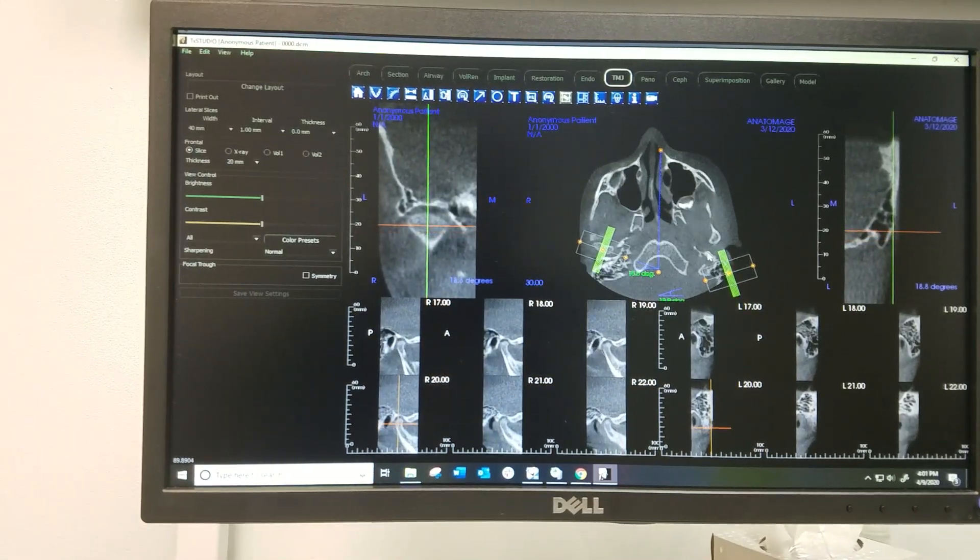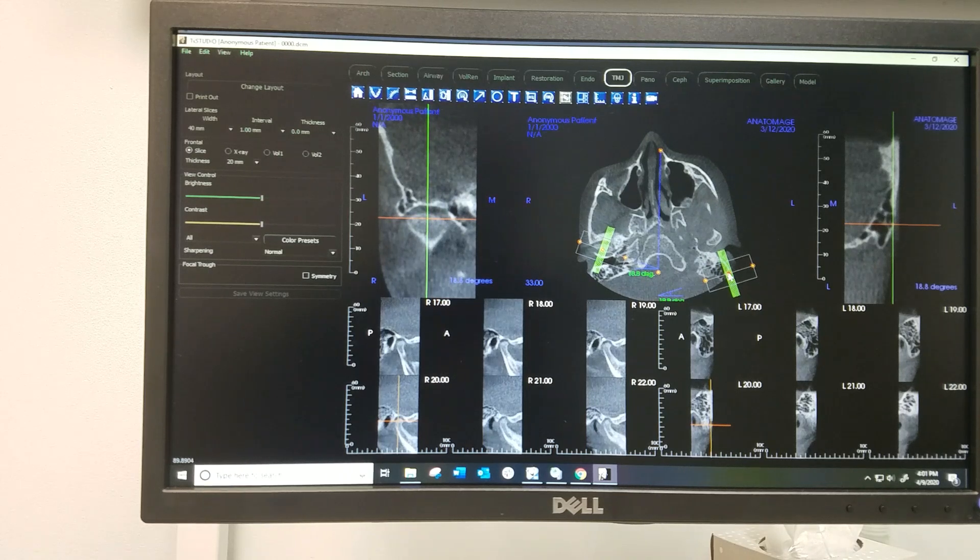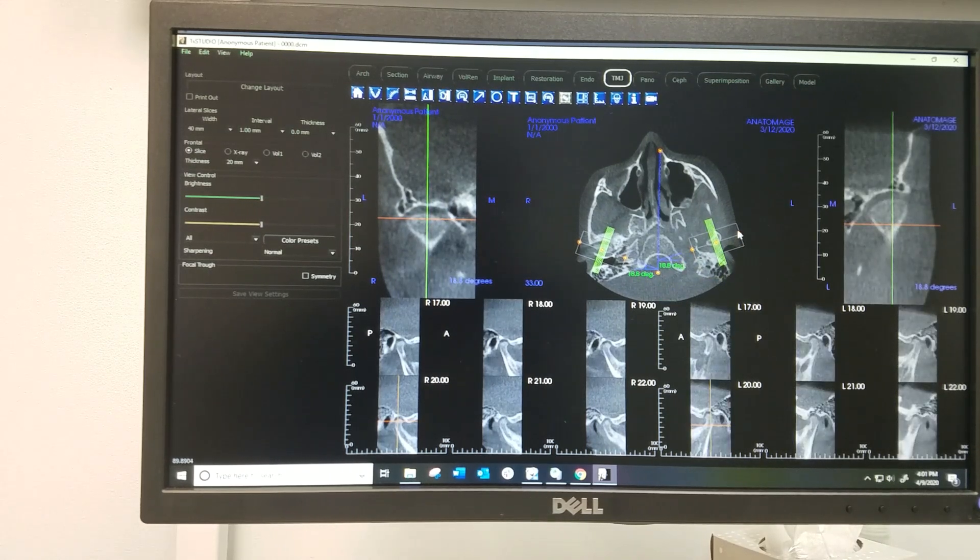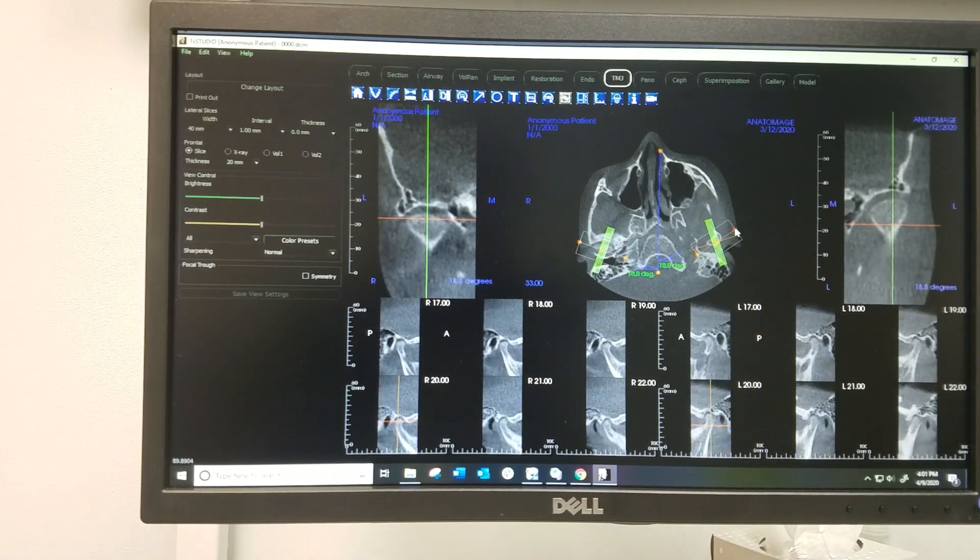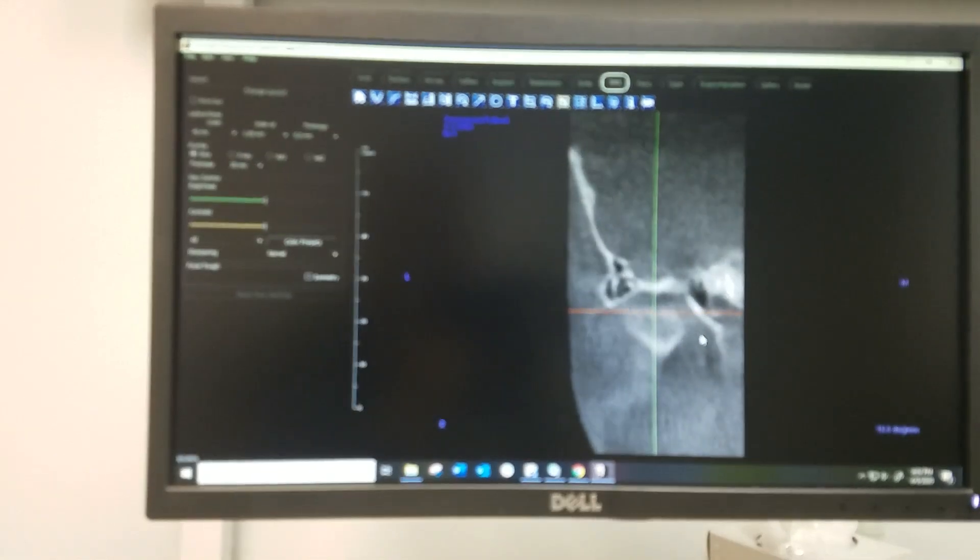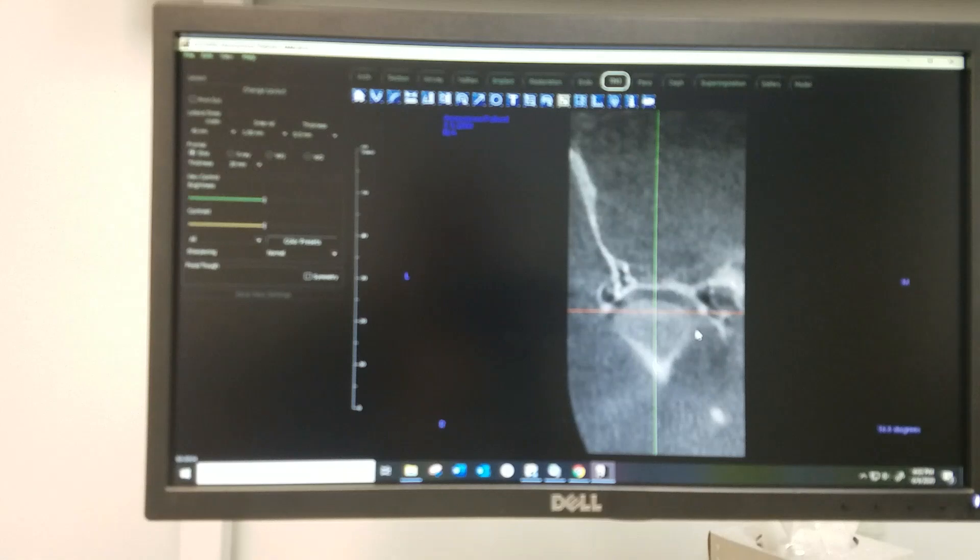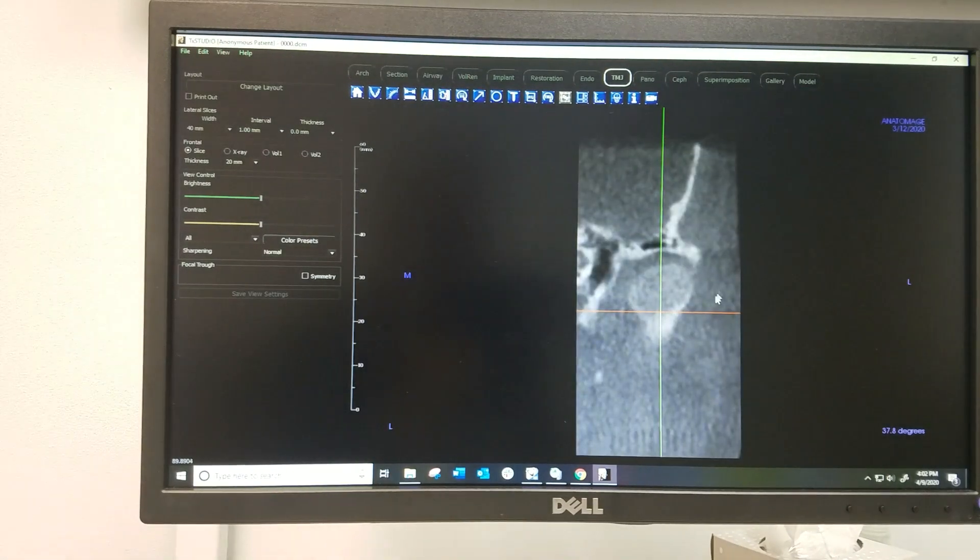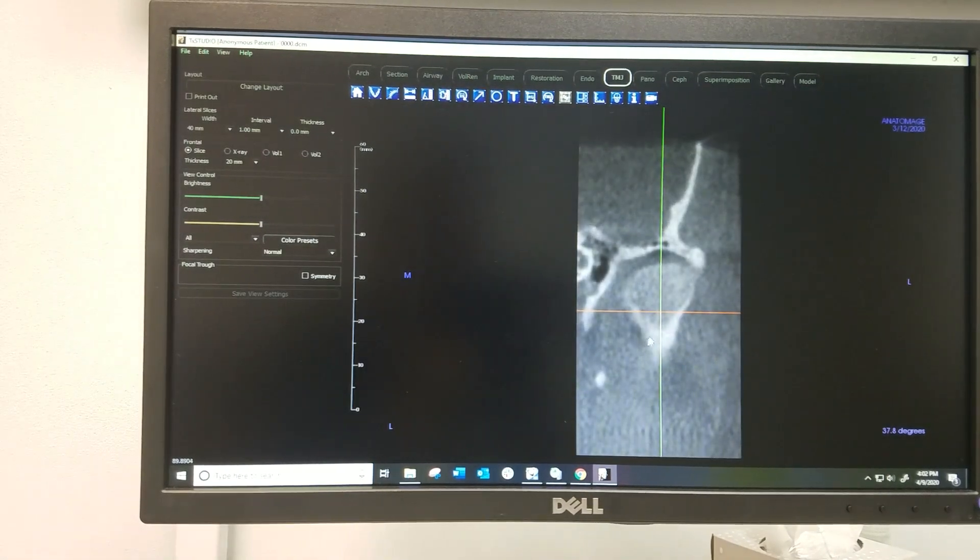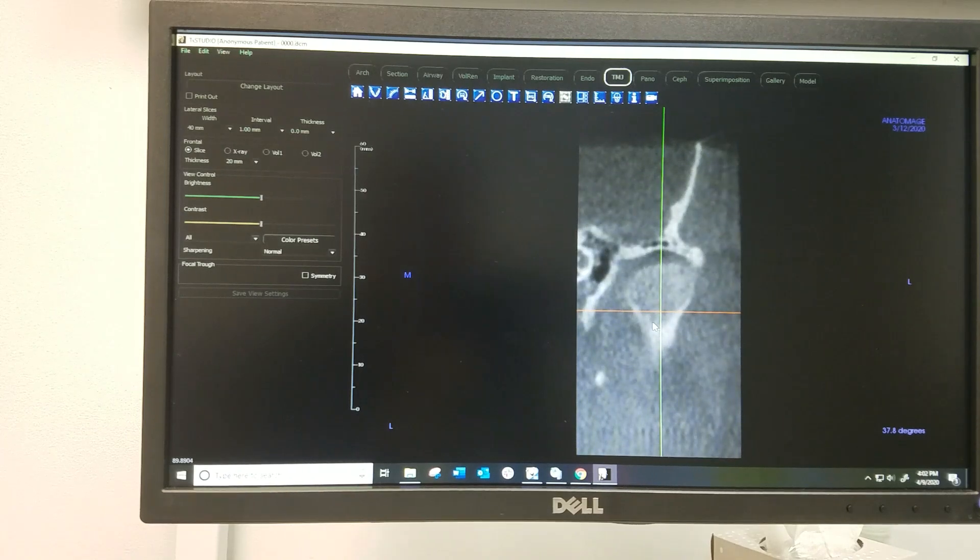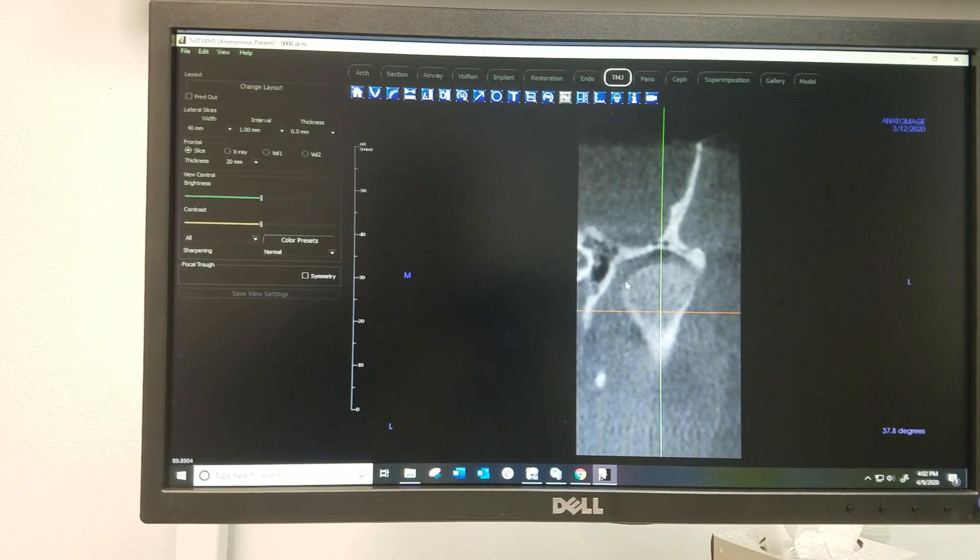Just by orienting that, we can get a good view of these jaw joints, and they should be nice and rounded and well-defined. You see how that's nice and rounded like that? Same thing on this side - it's nice and rounded and well-defined. It's somewhat central in the fossa there.